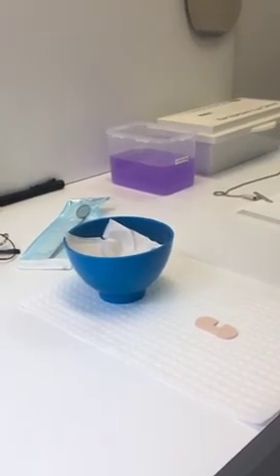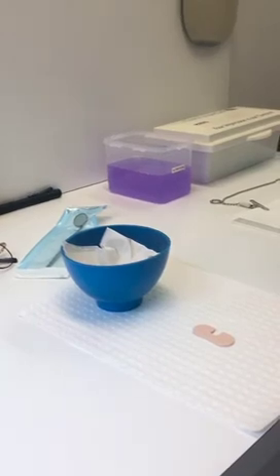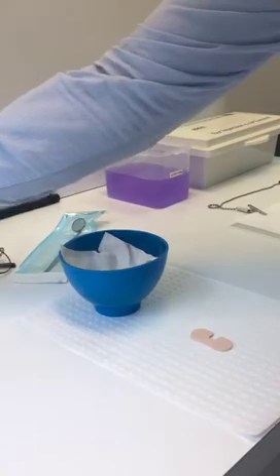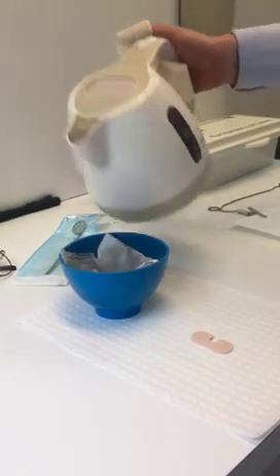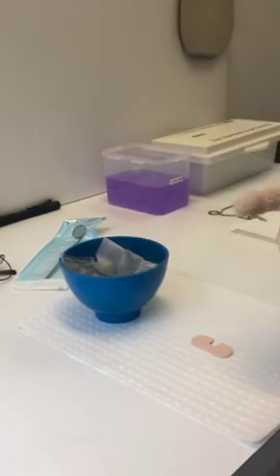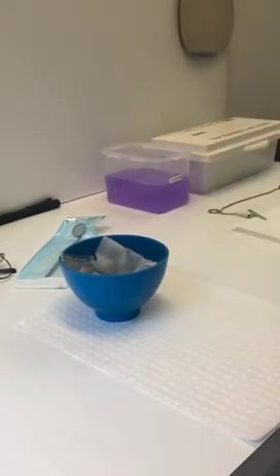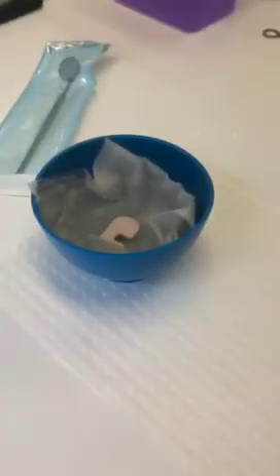Here we'll be forming the 3DS Align into a malleable material which we can then use in the mouth. Boil some water, then line the cup or glass with some paper just so the material doesn't stick. Gently dunk the material in and wait about 15 to 20 seconds until the material is quite soft.